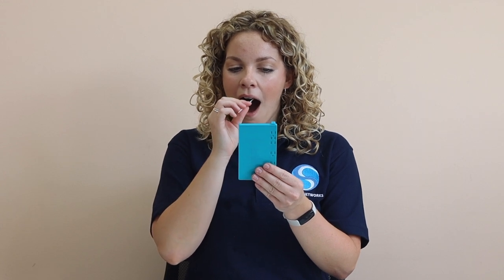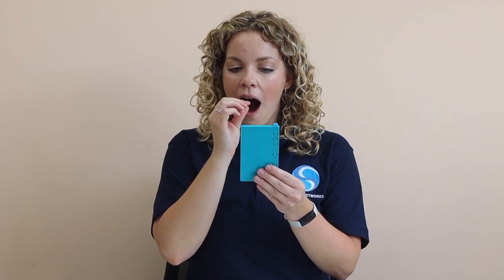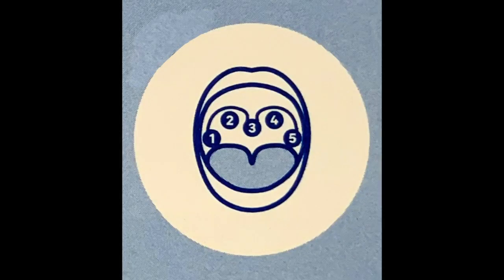Using a mirror for accuracy, open your mouth wide and rub the swab over the five key areas highlighted in the blue image. Make sure to avoid touching the tongue, teeth and gums.